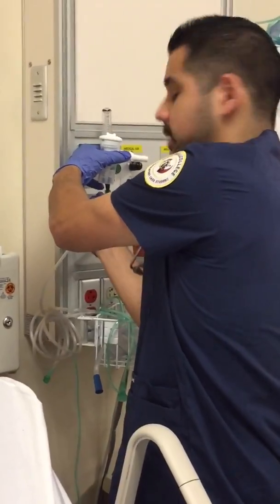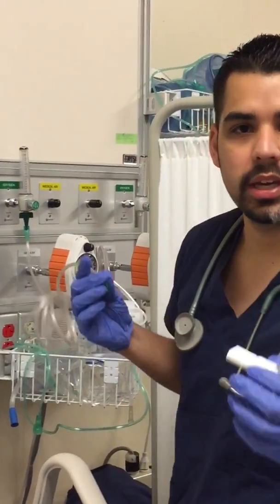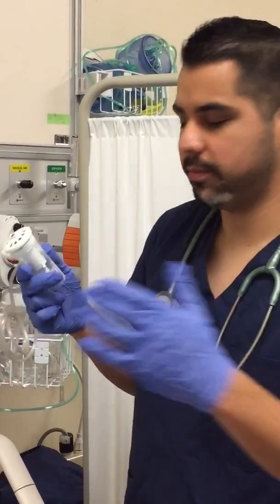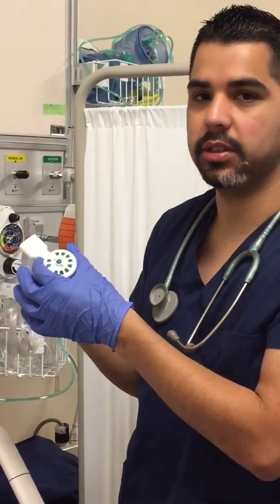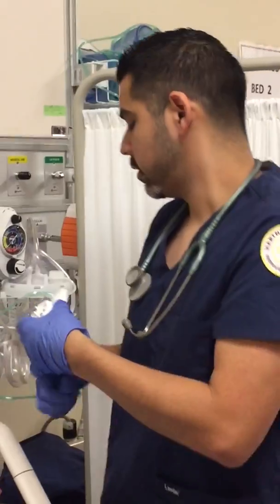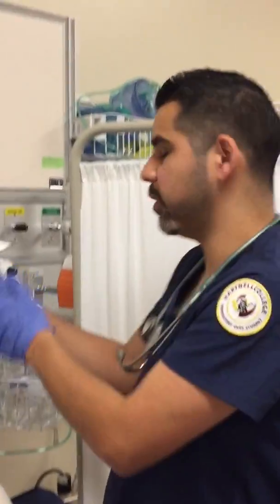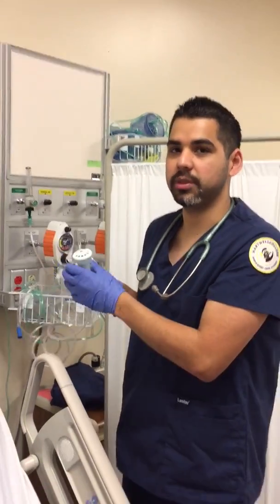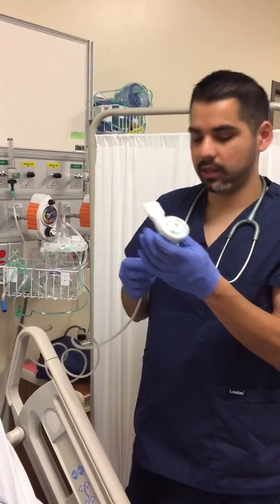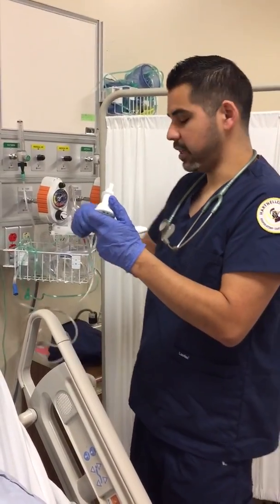So I'd like to make a note that sometimes when we get our small volume nebulizers, they will be in a clear bag that's closed off, and that prevents any outside bacteria from coming into the nebulizer itself. So after we give the patient his medication, we'll put it back in the bag, and then we'll put it behind him, just in case he needs another treatment. Most of the time these are found in the hospital in the bag, and they always have to be put away in the bag.